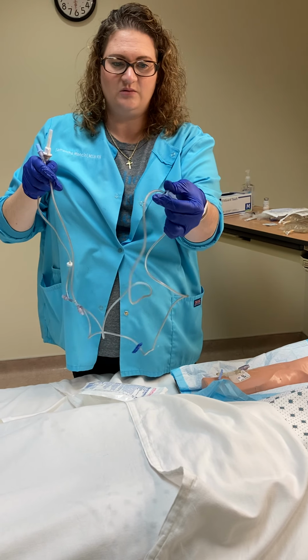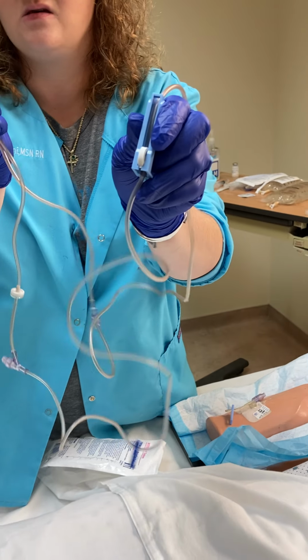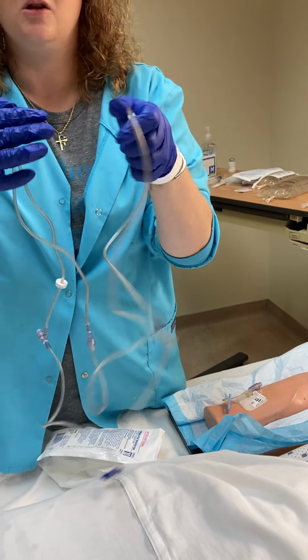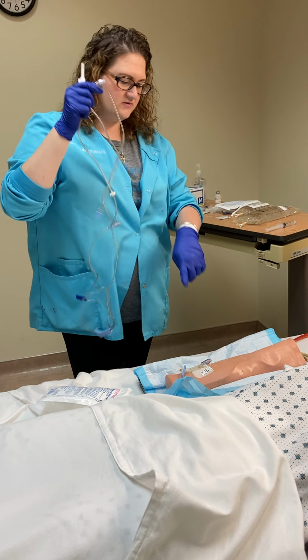Then you want a roller clamp. See, this wider part down here means that it's open all the way. And if we snug it up, that means that it's closed. You want it closed before you go to spike your bag. Again, we have the luer lock here that we're going to use with this one.